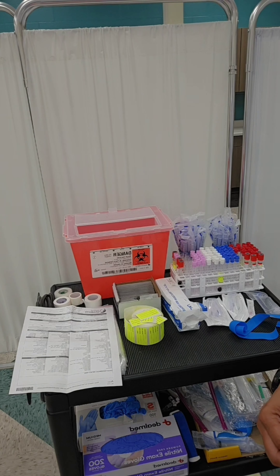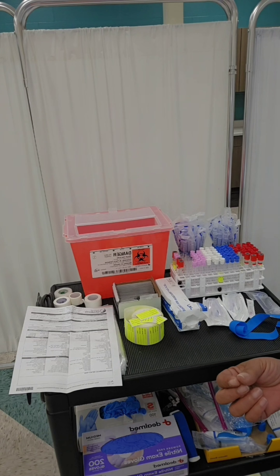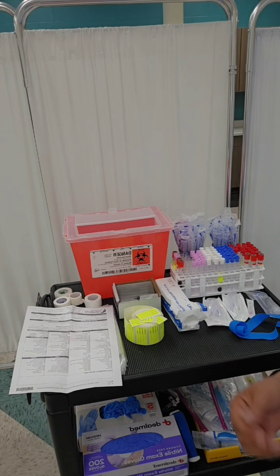What I like to do is go ahead and collect all of my supplies. I always collect a couple of extra two-by-twos, usually two pairs of gloves instead of one pair, and two to three alcohol pads just in case, because you never really know what will happen. So I always like to be prepared. I'm going to collect my supplies and then shoot the screen over to the table so you can see everything.